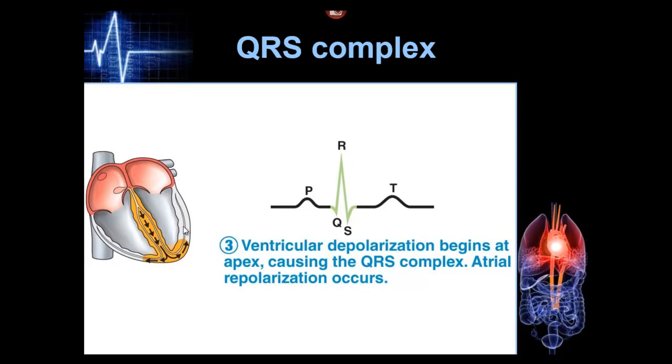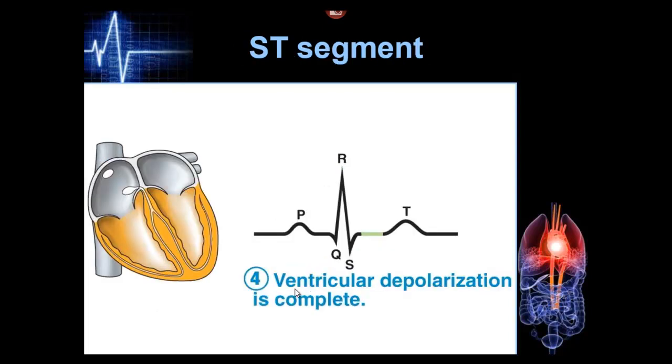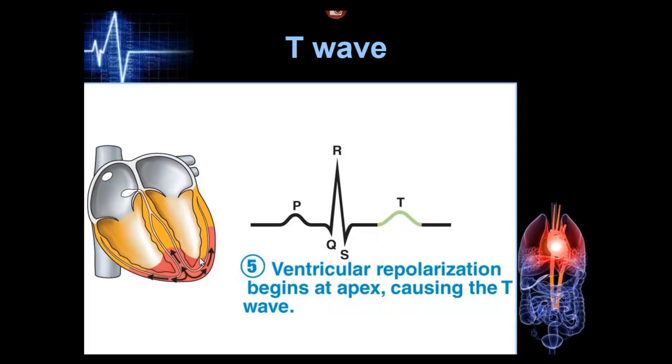See the QRS? That's the signal traveling up this way and that way, and it's causing the ventricles to contract, to depolarize. So it registers as all that electrical activity. There's a lot more muscle in the ventricles than the atria, so that's why it shows up as those big deflections. And then this is showing the ventricles repolarizing after they have contracted.